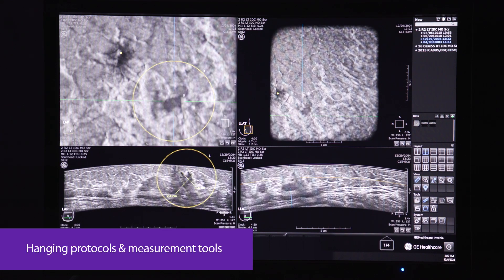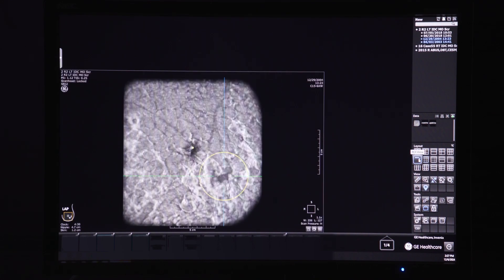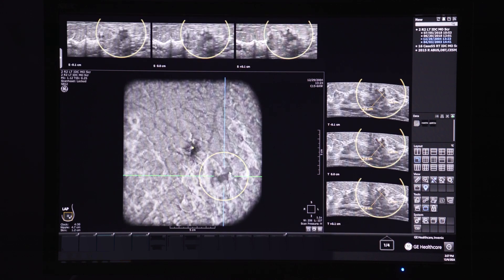Various hanging protocols, measurements, and image manipulation tools are available for thorough review and interpretation of images, and even to manage complex cancer diseases comfortably. These tools help to increase diagnostic confidence.